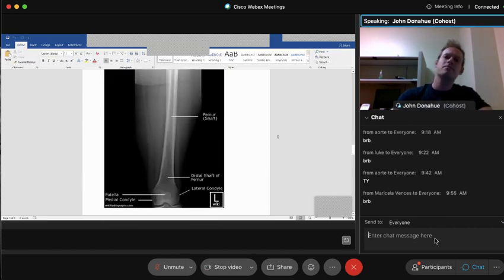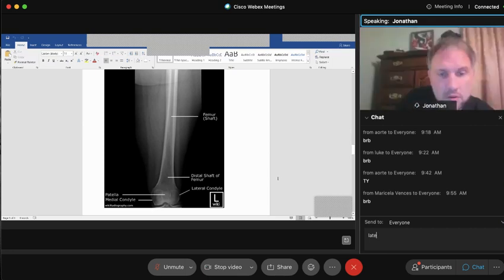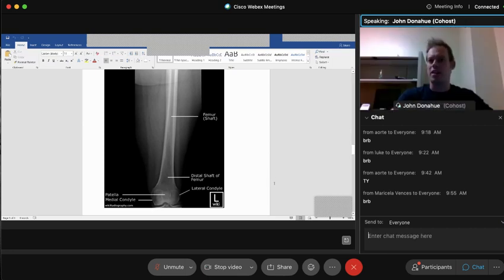All right, what's that one, guys? AP distal femur. Should be that entire name, AP distal femur.